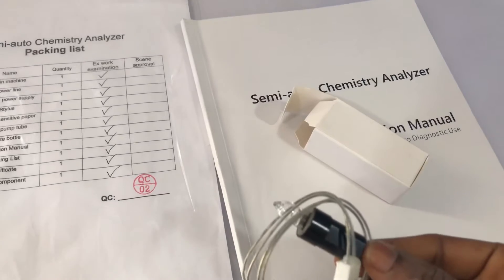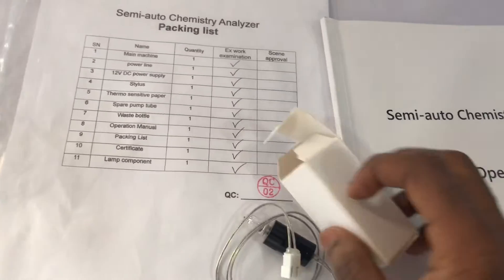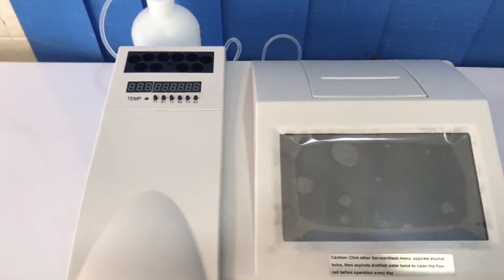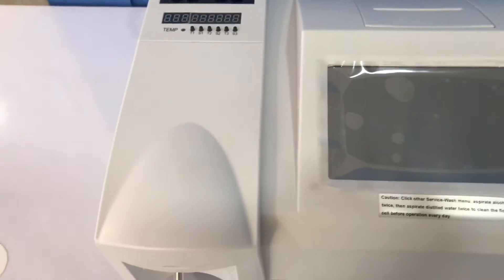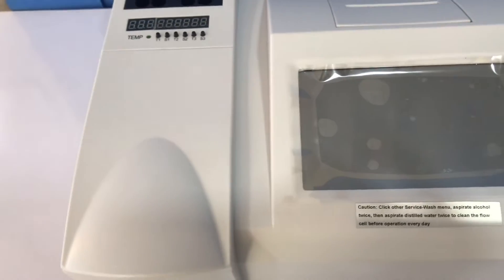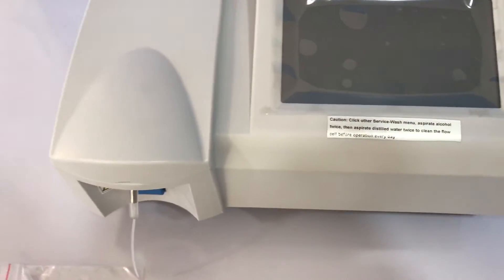In this video I'm basically going to teach you how to start this analyzer and some of the important maintenance procedures you have to follow to make sure your results are quality and reproducible. That will be the focus of this video.